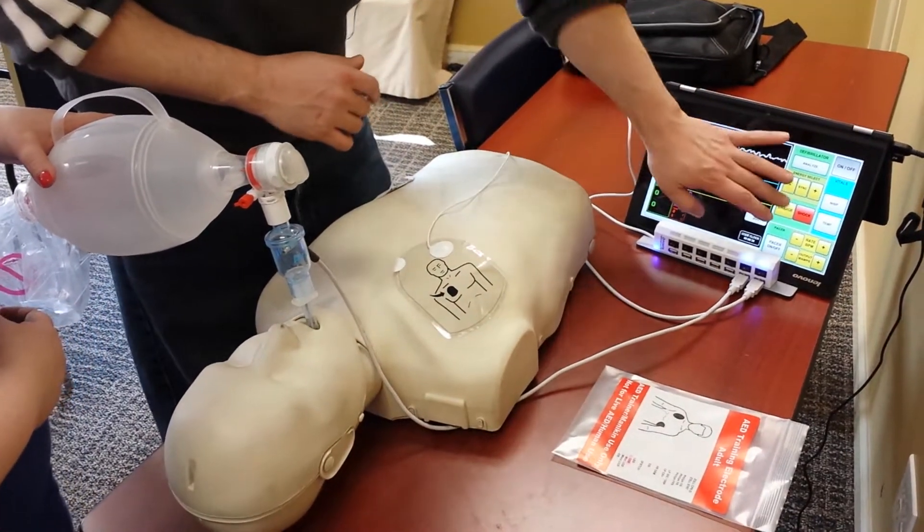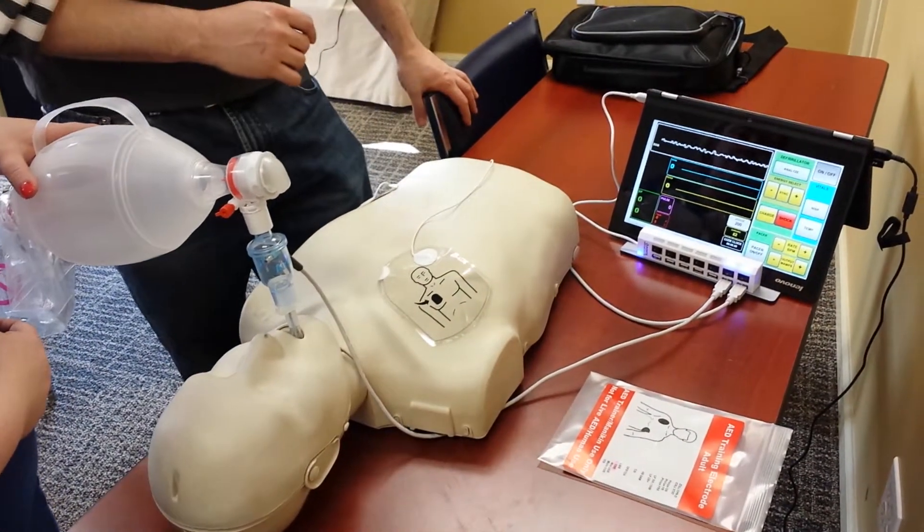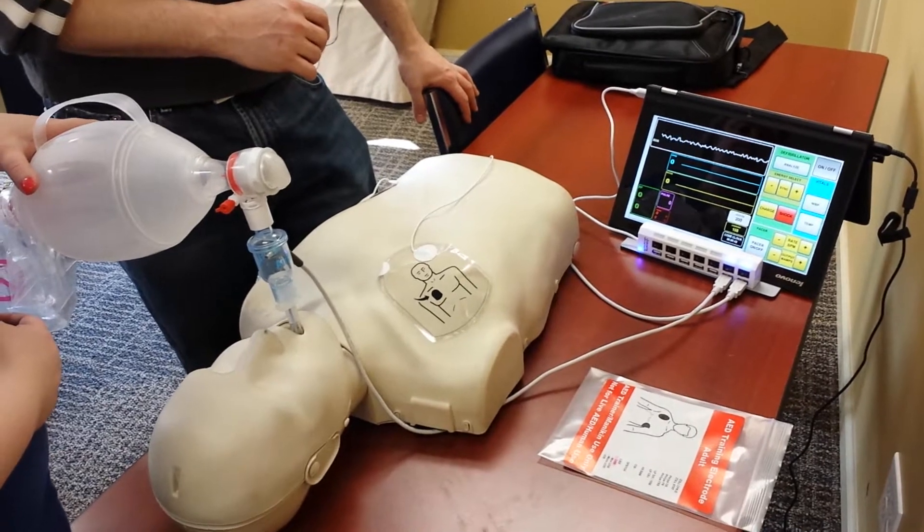Okay, we're charging. Charging. Stand clear. Everybody clear?